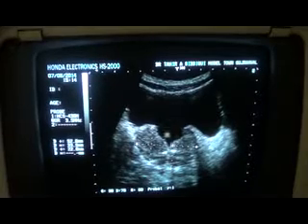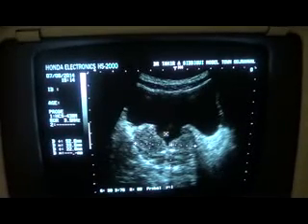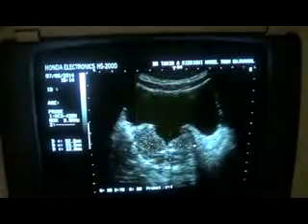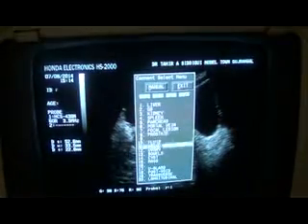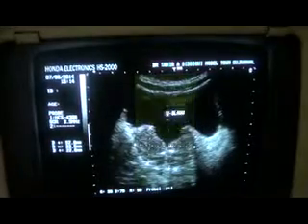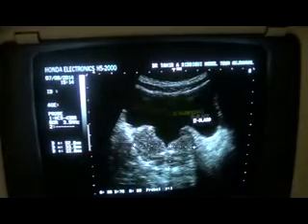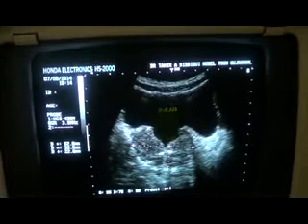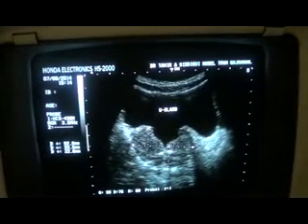Now this triangular shaped area is suggestive of the fact that this is the prostatic fossa and the proximal urethra. Now this is the urinary bladder in transverse section, this area. This is all urinary bladder. This is the part from where the prostate has been removed.